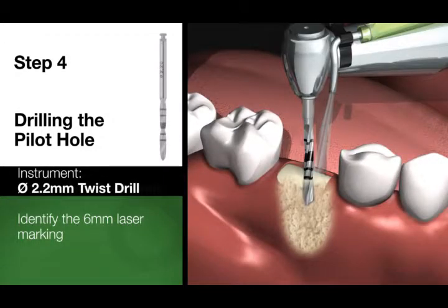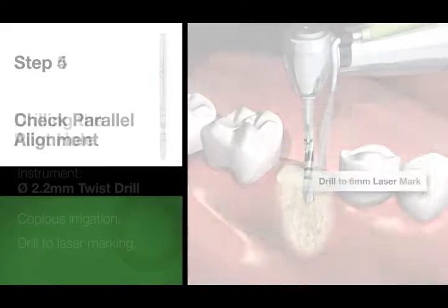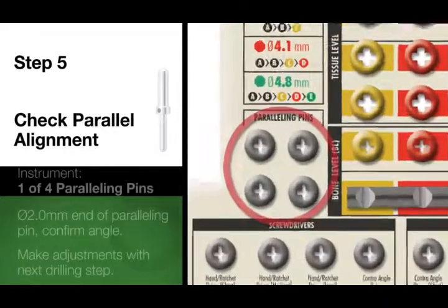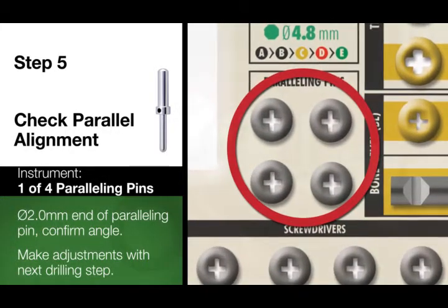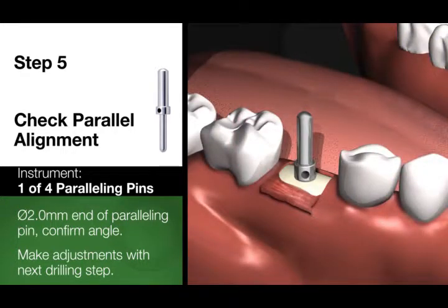Using the 2.2 mm twist drill, identify the 6 mm laser marking on the drill. With a motor speed between 800 to 1200 RPM and copious irrigation, drill to the 6 mm mark. Step 5. Check parallel alignment. Confirm the appropriate drill angle using the 2 mm end of the paralleling pin. Osteotomy corrections can be made during the following step.